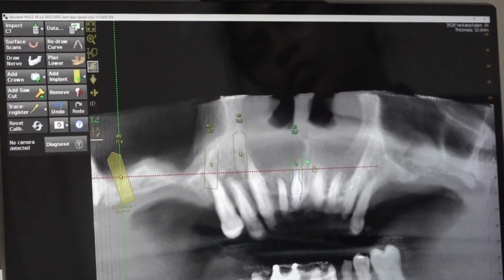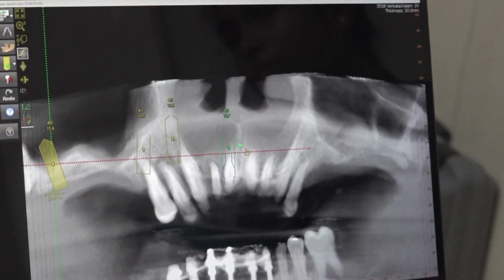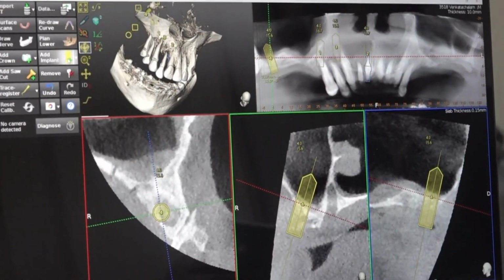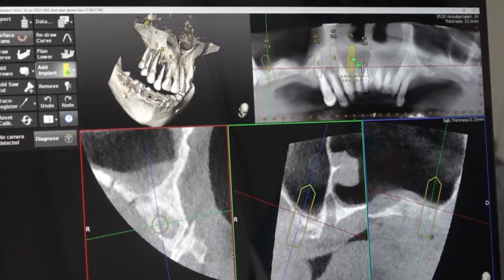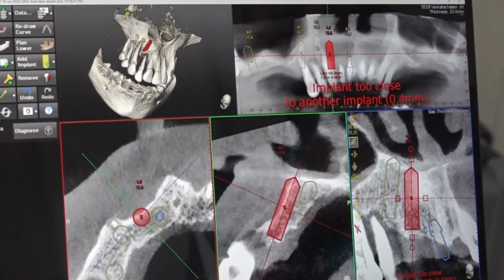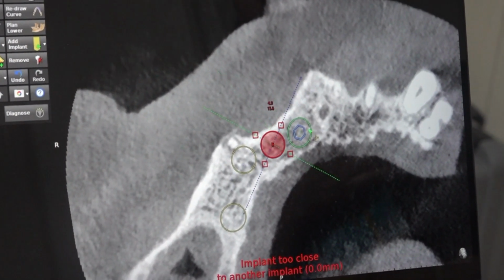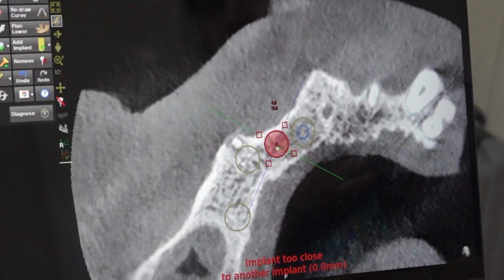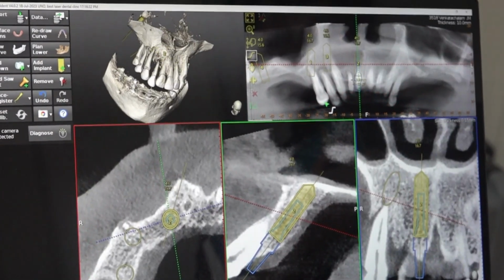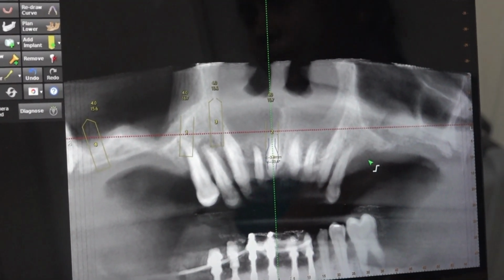If you are placing a single piece, definitely these 3 implants are not enough. Okay. Can you place one more implant here? The 1, 2? No. It will definitely be tight. Definitely it will show red, because it is, see here, do not see the panoramic image. It is close actually. So this is the point we are already repeatedly discussing. Panoramic view will cheat us.